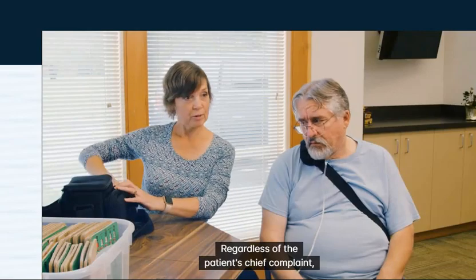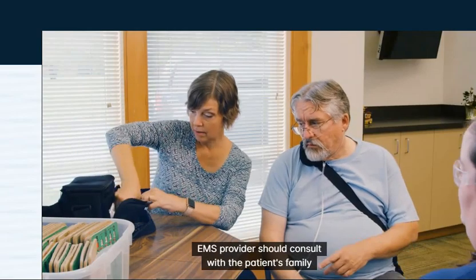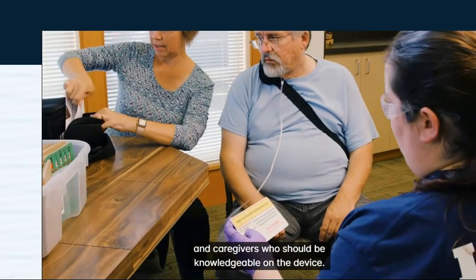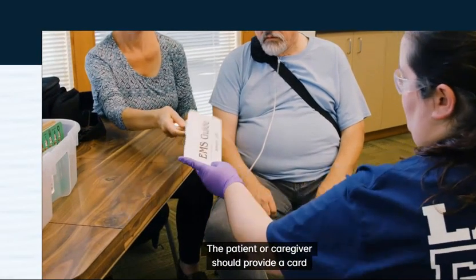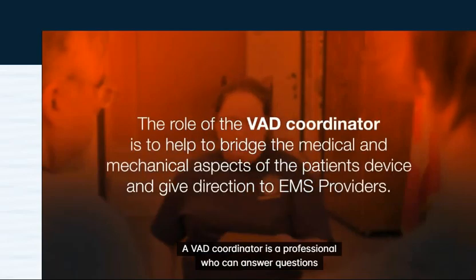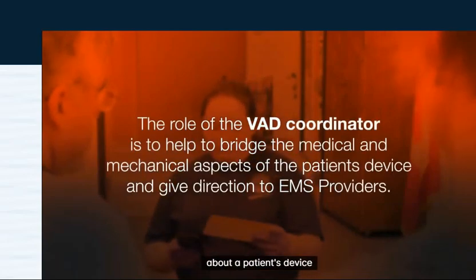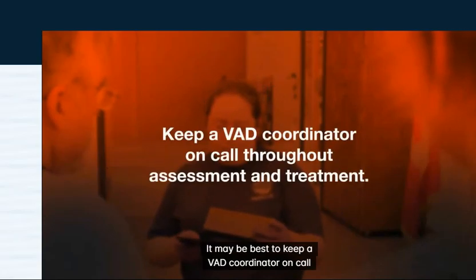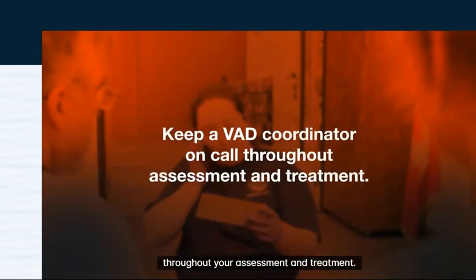Regardless of the patient's chief complaint, EMS providers should consult with the patient's family and caregivers, who should be knowledgeable on the device. The patient or caregiver should provide a card with contact information for the VAD coordinator. A VAD coordinator is a professional who can answer questions about a patient's device and give direction to EMS providers. It may be best to keep a VAD coordinator on call throughout your assessment and treatment.